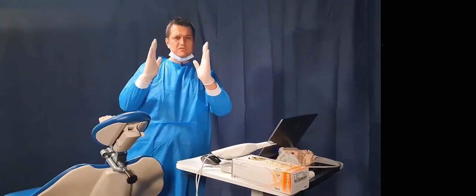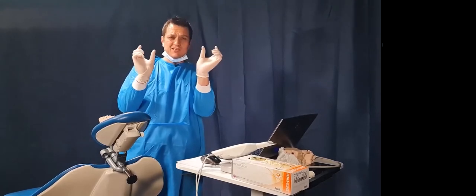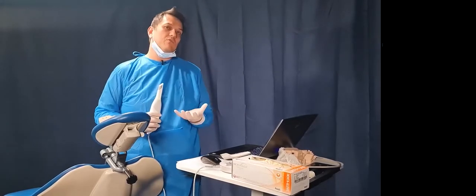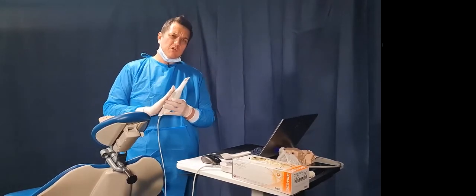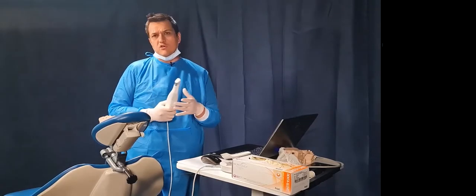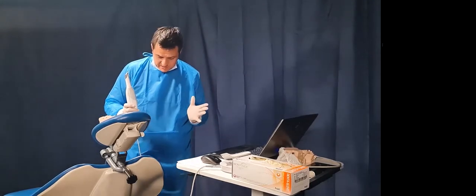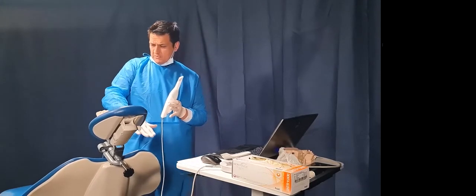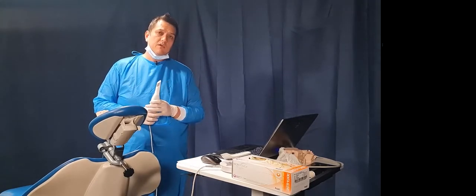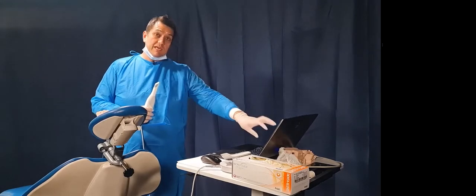The reason is because the gap between the adjacent teeth is quite small. You've got a big camera head going into a tiny little space, and how do I record those spaces? So I'm going to show you firstly on the mannequin, so you can get a clear vision of my hand position in relation to the patient. Again, remember we talked about it last week, so my patient right now is probably about right. We're going to do an indication on a lower here. We'll also cut to the scan screen as well.